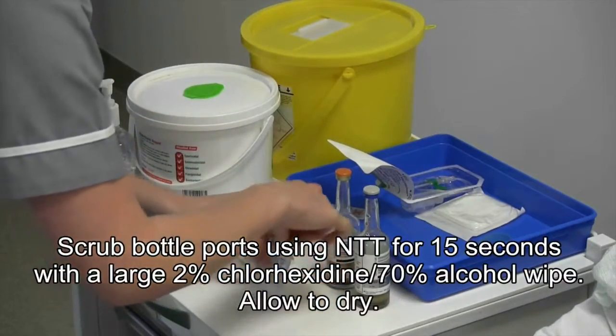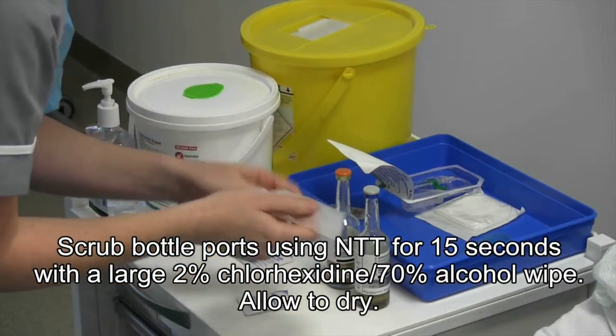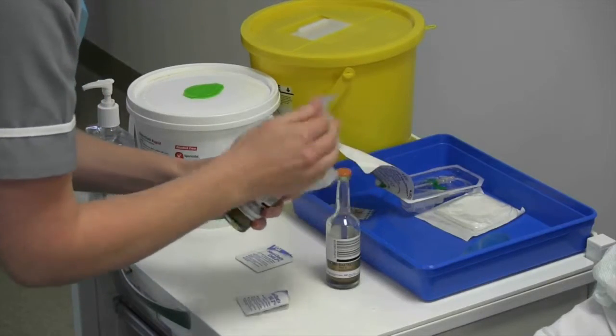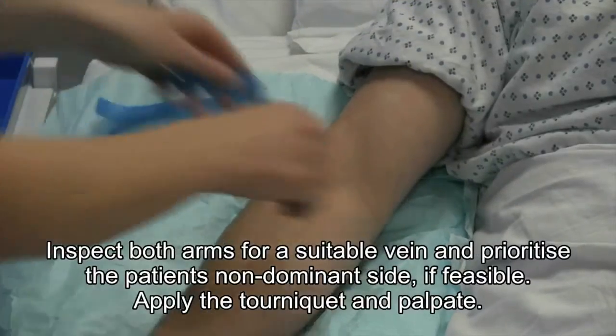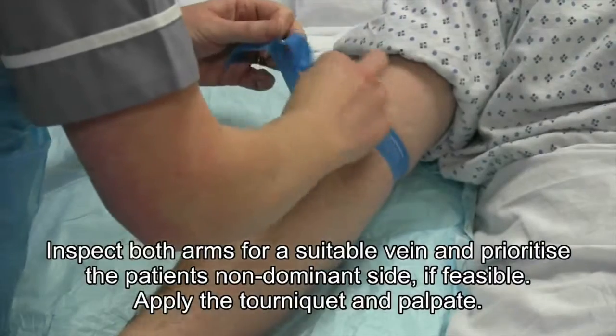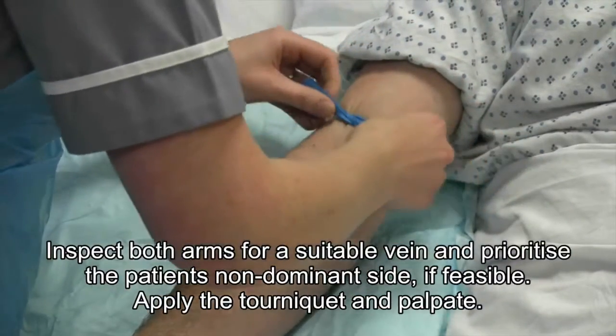Also, decontaminate the blood culture bottles as shown. Inspect both arms for a suitable vein, and try to prioritise the patient's non-dominant side. Apply the tourniquet and palpate.